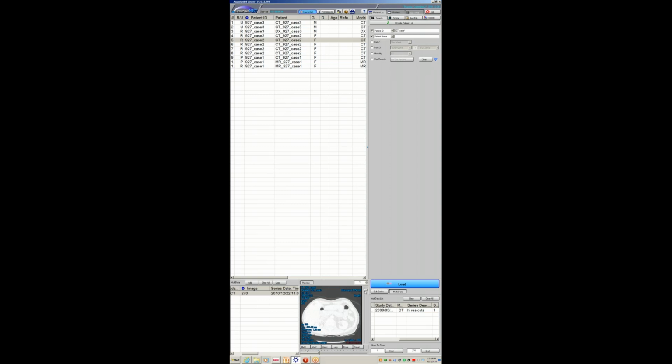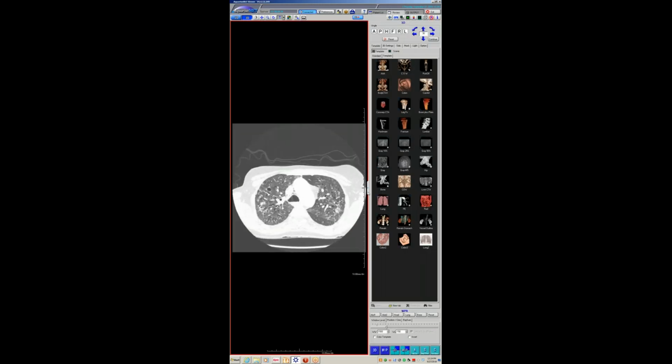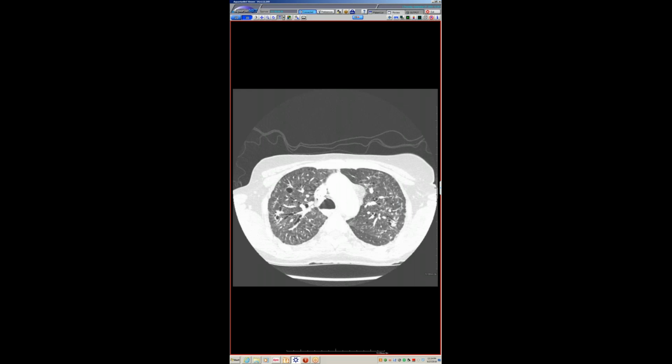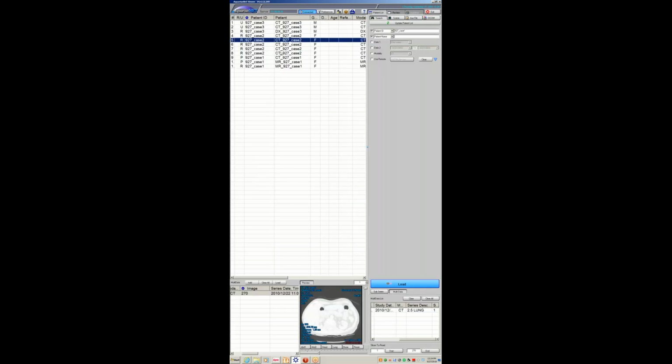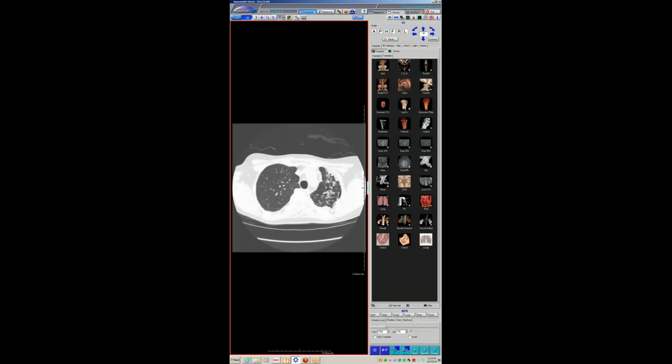But if I showed you guys that CT scan with all that scarring up there, without giving you the clinical context, I don't think anybody would call that PPFE because it doesn't have that peripheral finger. You're talking about this one or the most recent, the one in two? This one here? Yeah. Even this scar.